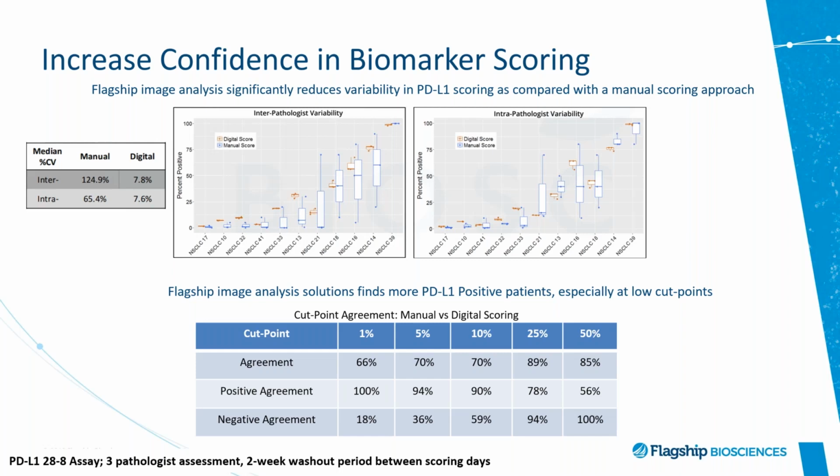And looking at the chart, you can see the much smaller variation in the error bars. And particularly, I'd like to invite you to focus your attention on the fact that this is particularly true at the intermediate level of expression of PD-L1, where often decision points need to be evaluated.